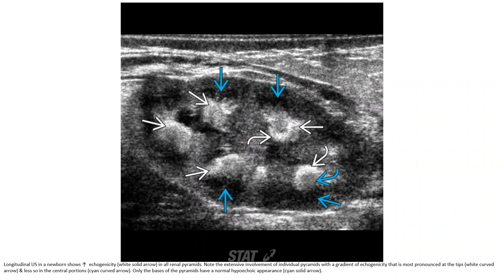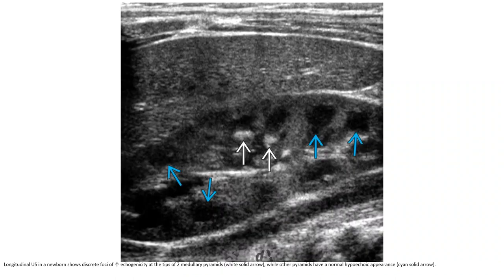This shows increased echogenicity in all renal pyramids in the newborn. The extensive involvement shows a gradient pattern, most pronounced at the tips and less so in the central portion. Only the base of the pyramids retains a normal hypoechoic appearance. In another case, increased echogenicity is seen only at the tip of two medullary pyramids, while other pyramids have a normal hypoechoic pattern.